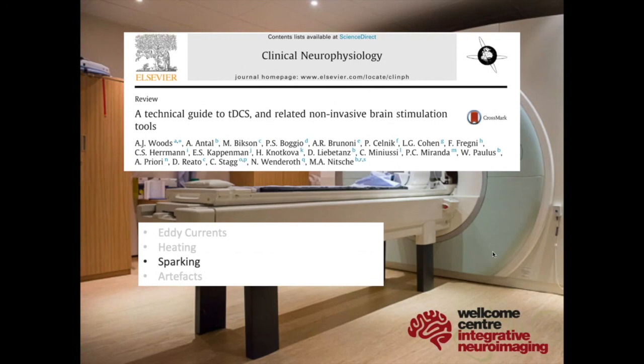We tested them outside the scanner and it worked, but it must have done something in between outside the scanner and inside the scanner. Suddenly we were seeing arcs of electricity. And the participant was completely fine. Obviously, we stopped scanning and got them out. They were absolutely fine, just a bit puzzled as to what this flashy thing was in their eyes.